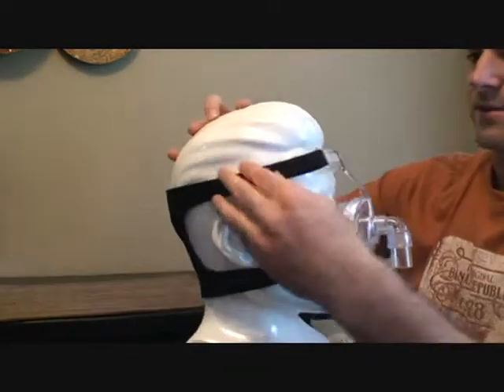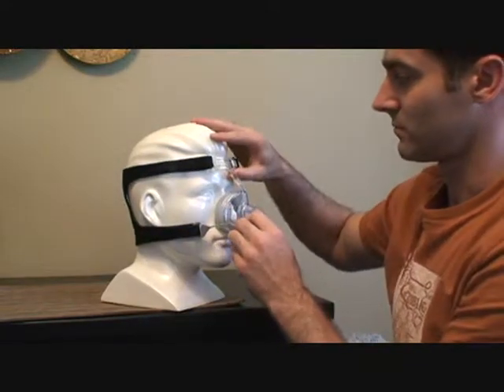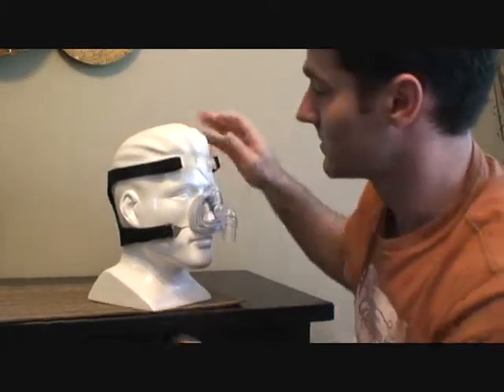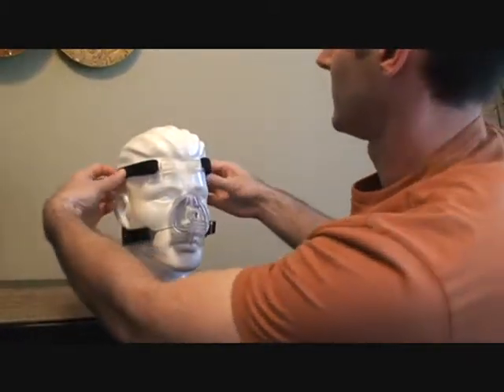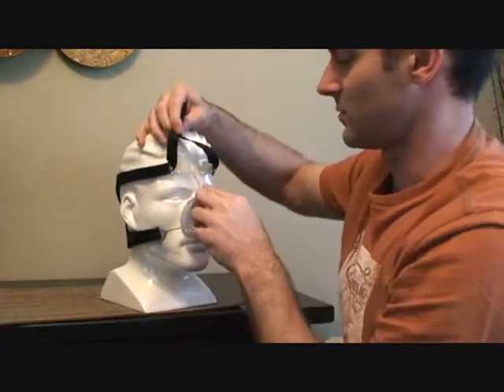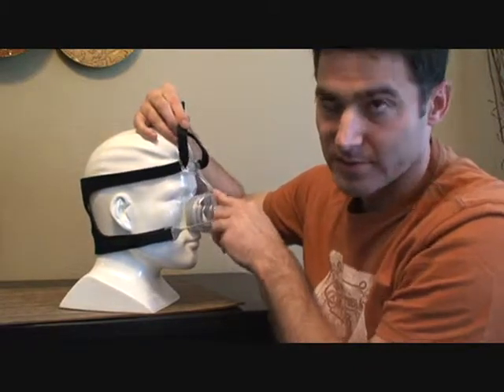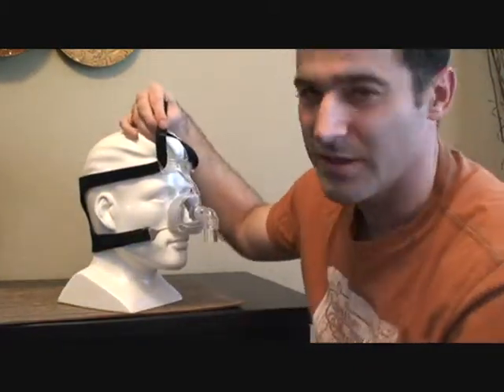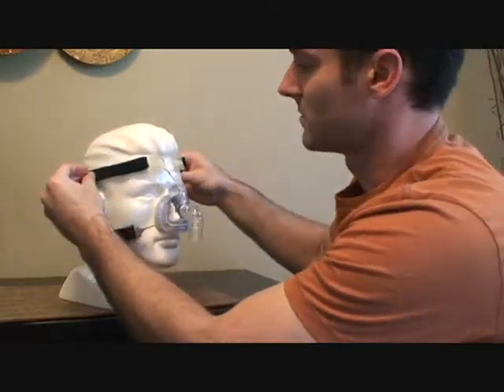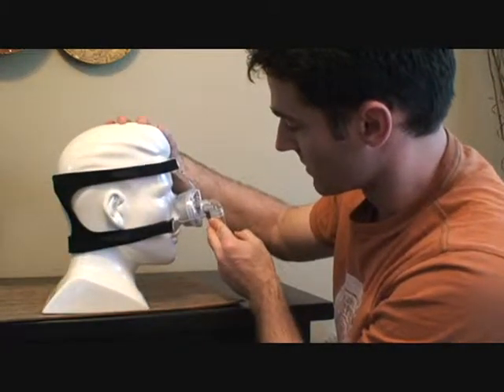So as far as tightening the top, you just want to make sure this is snug, not too tight, not too loose. Undo these Velcro straps, and this is supposed to flex. If I push on that, if it's tightened, it's supposed to flex so it fits your nose properly, but really you don't need to over tighten this at all. So just have it snug, put it back down, and then as far as the bottom, if you have leaking at the bottom, you can see that would be too loose for this person.